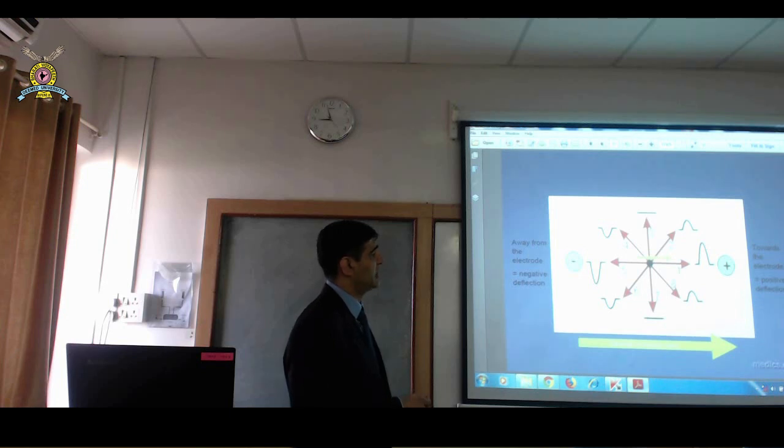So the electrodes are placed like this actually. If you look here, if the impulse is traveling in this direction, you will get a positive wave. And here, with the same impulse, you're going to get a negative wave. Here you're going to get a little positive. Here you're not going to get much, because it's at a 90-degree angle to this. The wave is transmitted this way. Here you're going to get nothing. Here you're going to get little waves. Here you're going to get a positive wave. Here you're going to get a negative one.